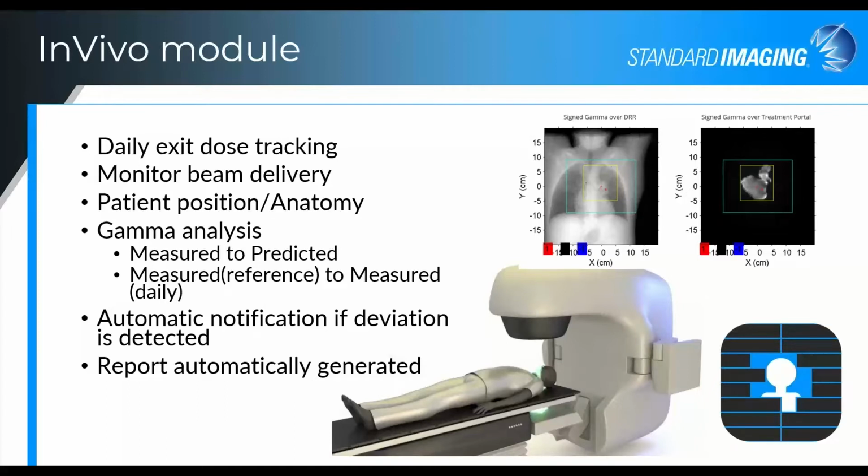As well, there is gamma analysis. What I'm showing here is the hot-cold gamma, which we hear from our customers is the preferred option. Of course, you can use the standard gamma, going from 0 to 1 instead of having the hot-cold portion multiplied in.